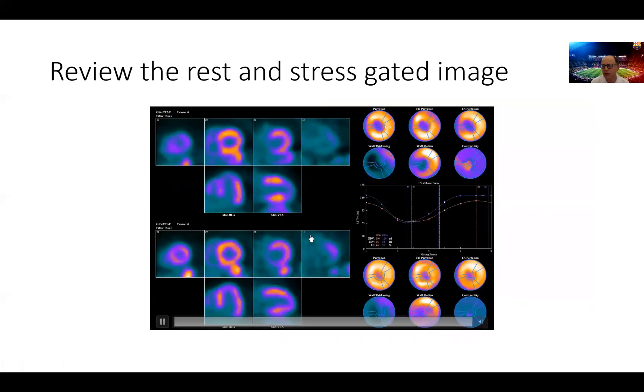The next images are the gated images, the rest being on the bottom, stress images are on top, and right away your eye is drawn to the fact that the left ventricle has some minor wall motion abnormality in the apex, which is exaggerated during the stress where the apex becomes akinetic.